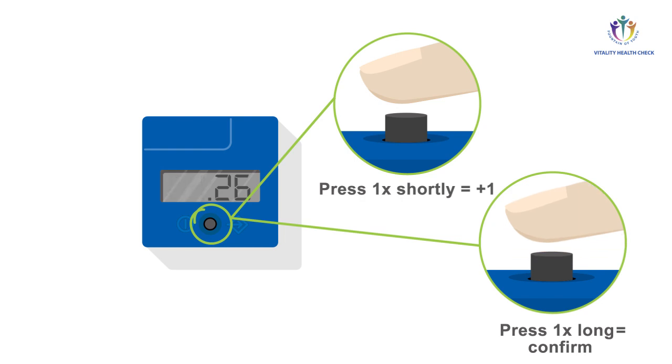Now you may change the month and day settings by following the same principle. Press the button short to change plus one. Press long to confirm.